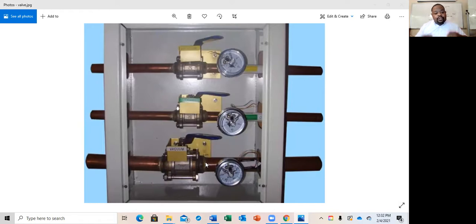you don't get any of that. That'd be terrible if it was their actual secretions going throughout the hospital. That'd be germs everywhere, right? Okay. So this is what's called a zone valve. All right. This is a zone valve.